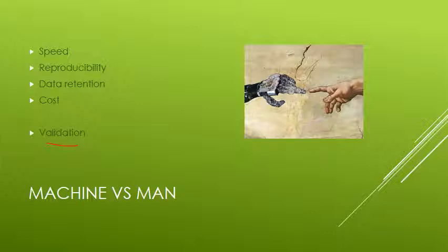Now, those are things that you would probably more likely apply to, say, a chemistry machine, right? Reportable ranges and stuff like that. In micro, we're really looking at sensitivity, specificity, and then, of course, reproducibility and correlation with our manual methods. There's no real reportable range, right? In micro, you're not really supposed to have pathogens growing in you.